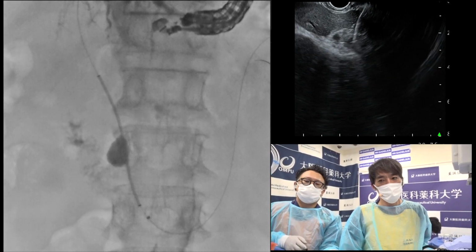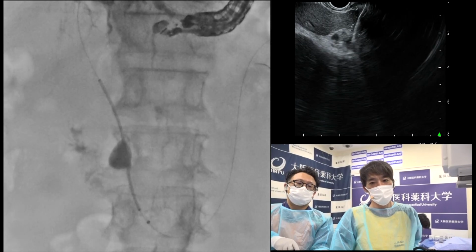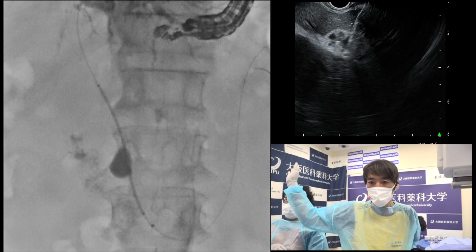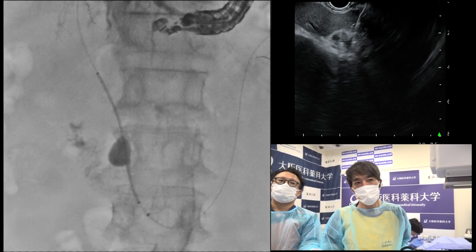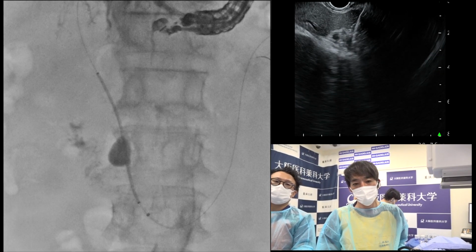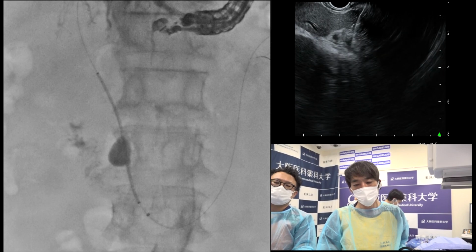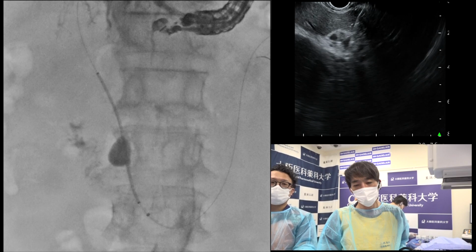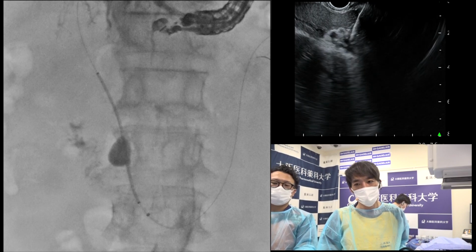associated with more recurrent cholangitis in patients with gastric outlet obstruction. However, nowadays we are performing GJ as well. So with the use of GJ, maybe the difference may not be so significant. Actually, in the era of GJ, I think we probably need to compare the patency of CDS versus HGS again. So, Ogura Sensei, are you ready?